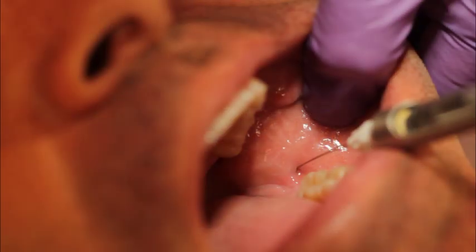However, for non-surgical periodontal therapy of the mandibular molars by a dental hygienist, especially with furcation involvement and root concavities when visibility is necessary, the LB block is often necessary and should be administered immediately after the inferior alveolar block.